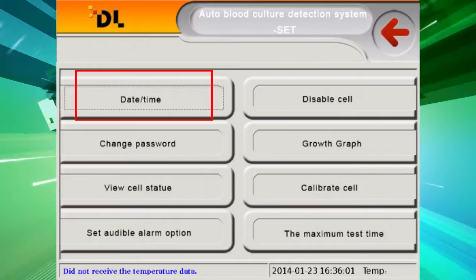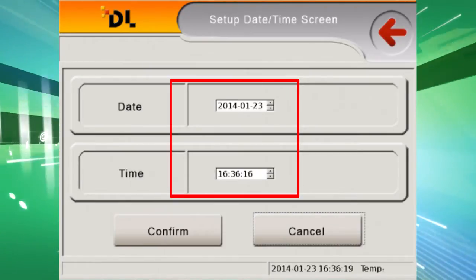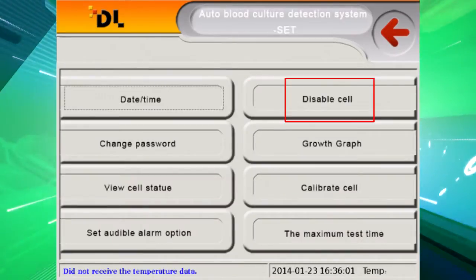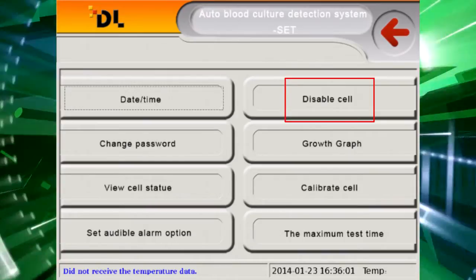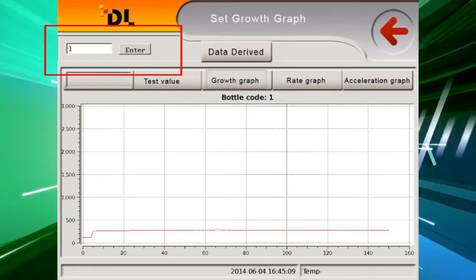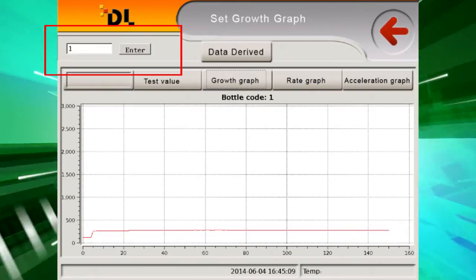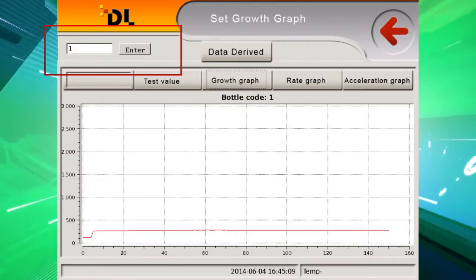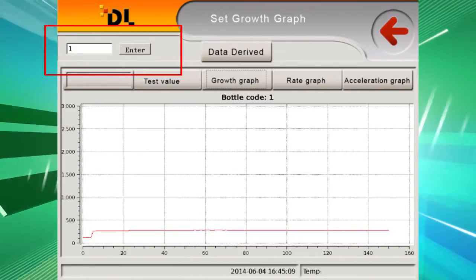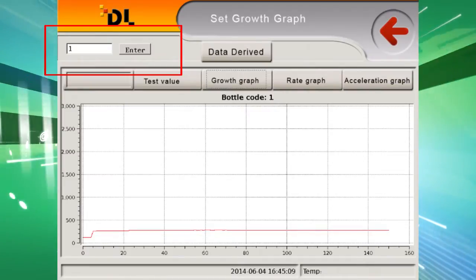System Setting allows you to set the current date and time. When setting the date and time, please make sure there is no bottle in the instrument, or it will affect the testing result. You can also set whether a well is usable or disabled — if the cell is disabled, it will show as invalid. Growth Graph: input the barcode or well number to check the bottle growth graph. The X-axis represents detection times and the Y-axis represents the expressional color frequency for bacterial growth. The inserted bottle data will be kept in a daily file named by year, date, hour, minutes, second, and cell number. If there is a barcode, it will be named by barcode.